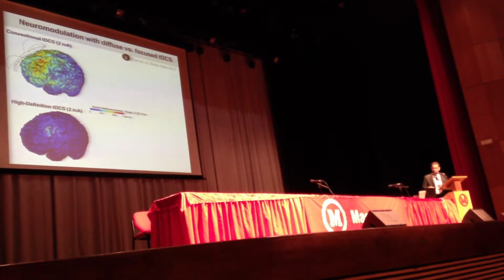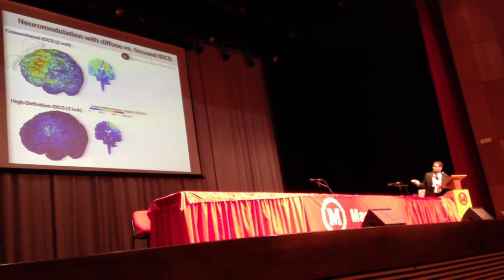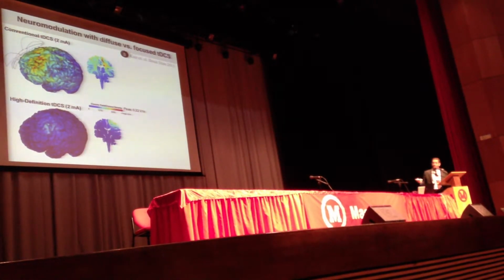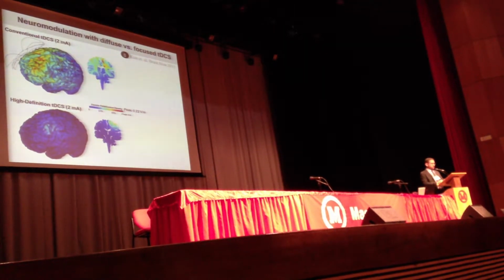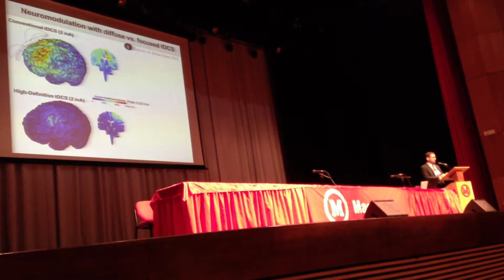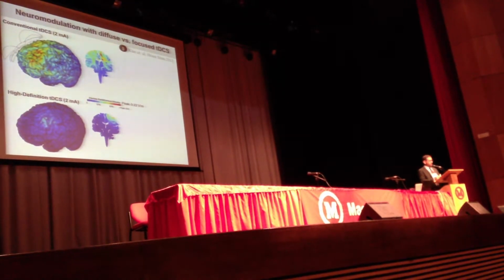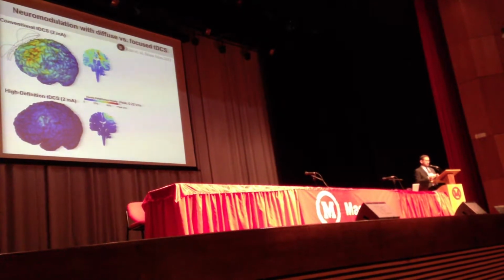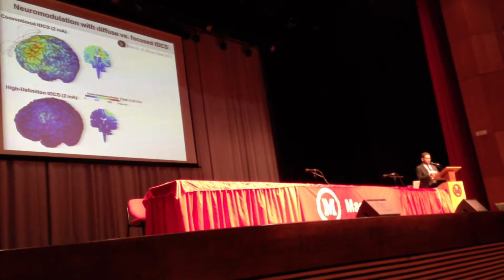So if we look at that motor region in more detail, you can look at it here in this cross-section through M1, or you can just look right here with your eye. You can see that actually in M1, the difference in the electric field generated in the motor region is not as dramatic. Now with a 4x1 montage, much less current enters the brain than with a conventional. But the current goes through much less part of the brain, much less volume. So even though less current is entering the brain, the electric field you get may be comparable in the motor region.